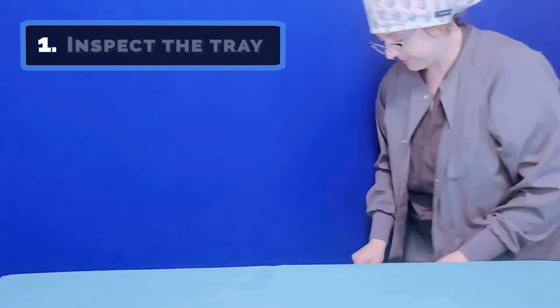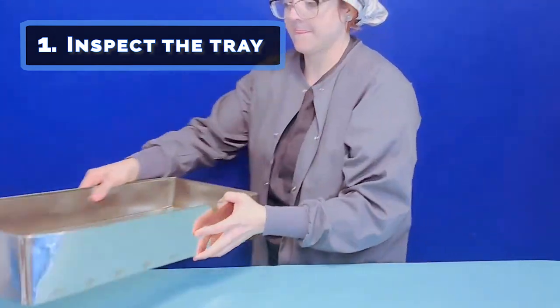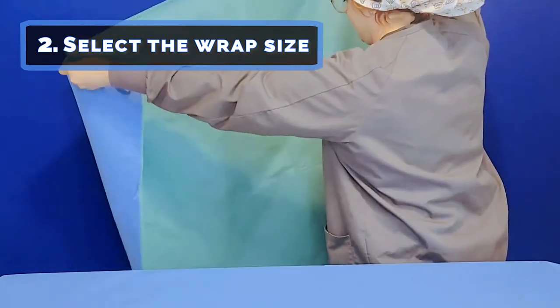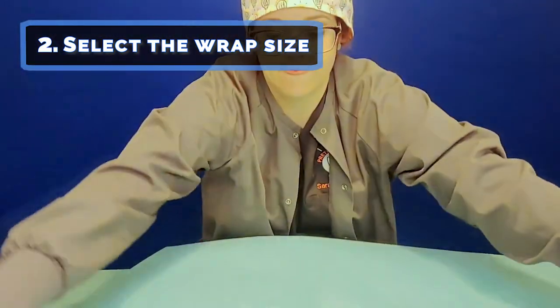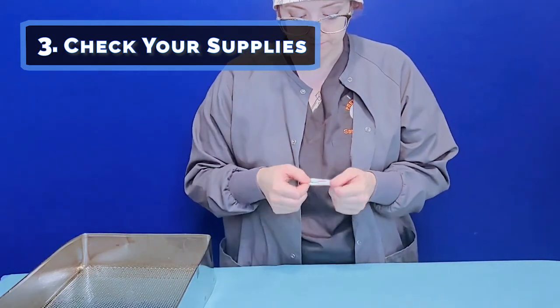Now that all the ground rules are laid, our SMS Unite wrap is ready. Let's bring this wrap battle on. For both wrap techniques, we're going to 1. Inspect the tray for cleanliness and functionality. Don't do this over the wrap you plan to use. Unbeknownst to us, debris could fall off the set and be wrapped up with it. 2. Select the wrap size according to IFUs and the guidelines or recommendations mentioned earlier. Total coverage of instrumentation is recommended. So even though a smaller wrap may look nicer, we may not be achieving appropriate coverage. 3. Make sure you have all the supplies: integrators, steam tape, and wrap. Then check all of them for quality and possible defects.